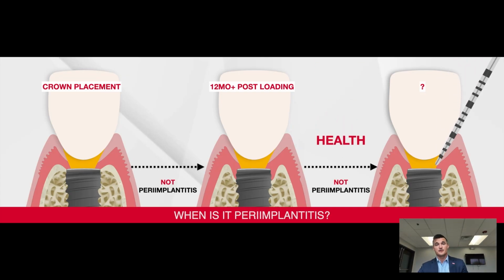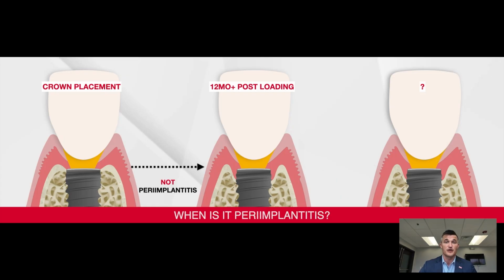Thereafter, let's say those bone levels remain stable. In that case, we have an implant that we consider to be in health. There is no change in bone levels, there's no inflammation here, so this is a healthy implant regardless of where those bone levels were at 12 months.